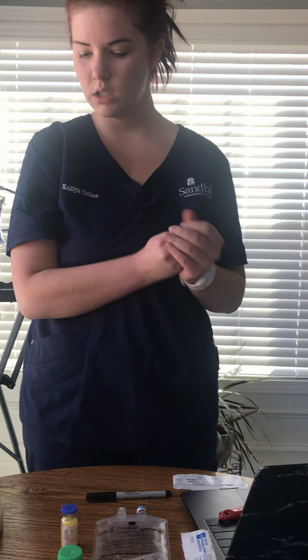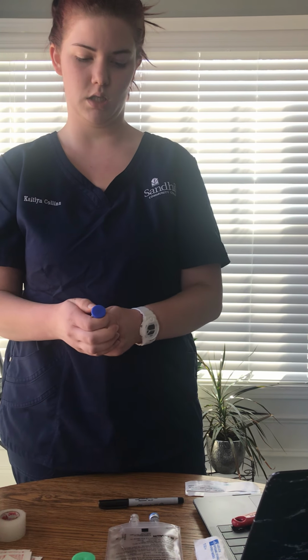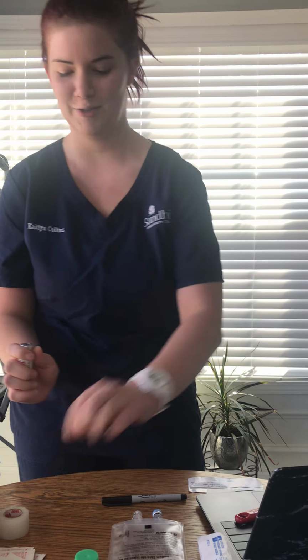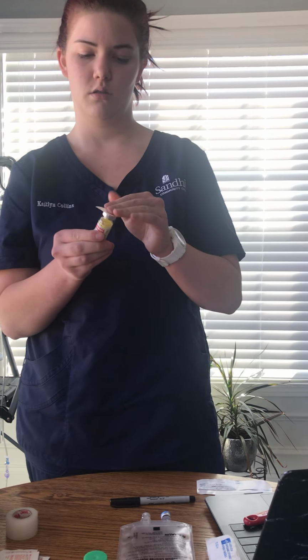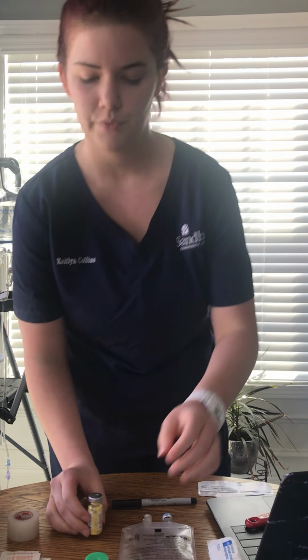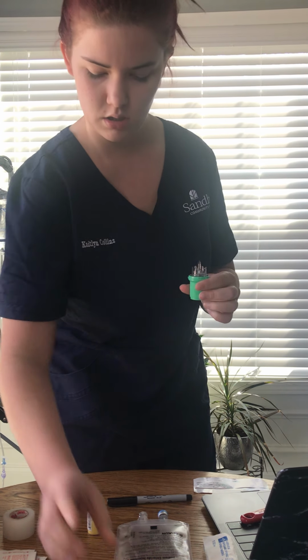So wash my hands. I'm going to get this ready. So I pop this cap and throw that in the trash. And then swab this for 30 seconds. Vigorously. And trash. And then I'm opening this.